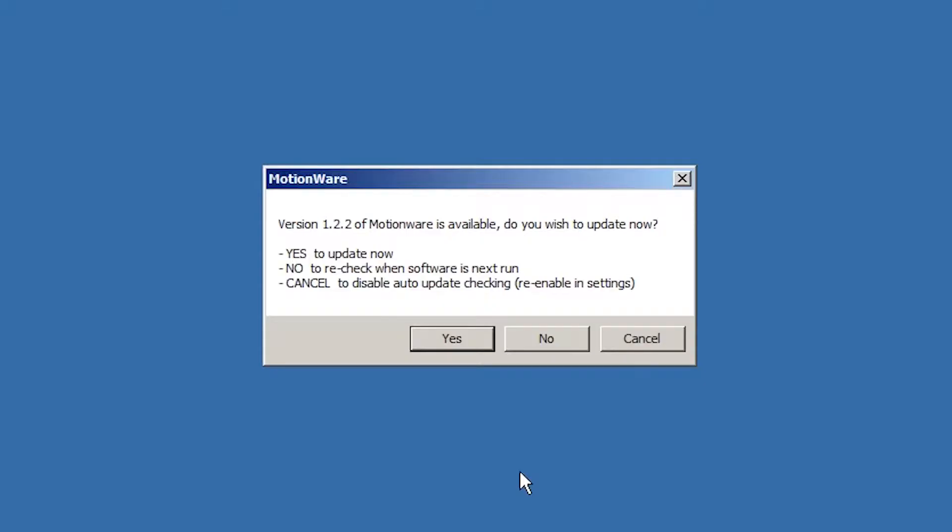The first time that the Motionware software is run, it will attempt to automatically check for updates. If a newer version of Motionware is available, a message similar to this will be displayed.